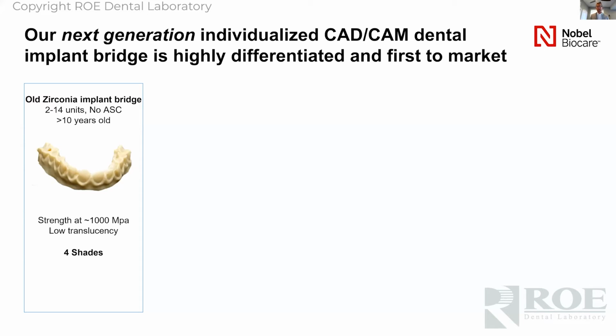Obviously, angulated screw channel technology had not been incorporated into dentistry at that time yet, so there was no ability to change the angulation. It was very strong for the time, about 1,000 megapascals of flexural strength. But one limiting factor was the aesthetics: fairly low translucency, in today's age very low translucency, and only available in 4 shades. What this meant is the amount of manual labor that it took for a dental technician to put this case into fruition was pretty extensive.